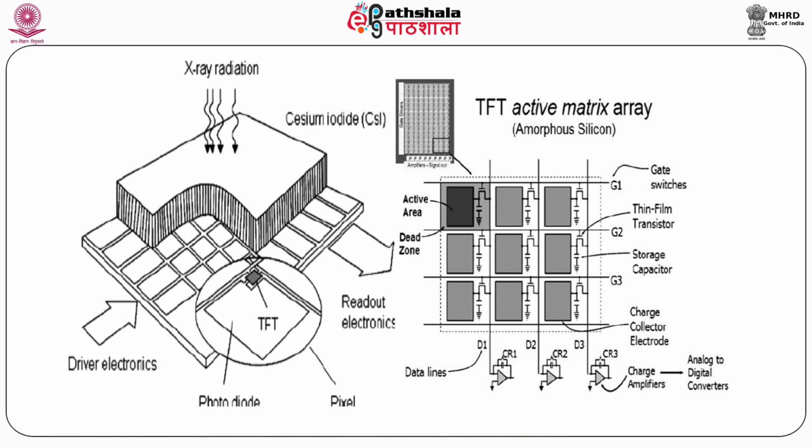Therefore, the plate is exposed to very intense light of sodium light, which removes all the metastable electrons to their ground state, thus emptying most of the F center electrons, and therefore now the cassette is ready for use for another exposure. Otherwise, if this is not done, then some remnant image will be lying, which might produce an artifact known as a ghost image artifact. So the remnant image might be visible on the image.